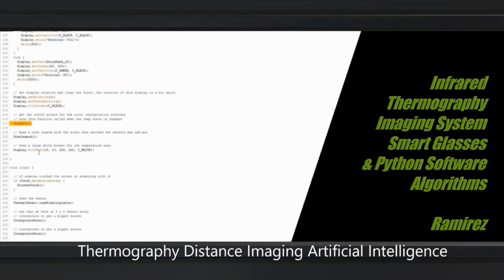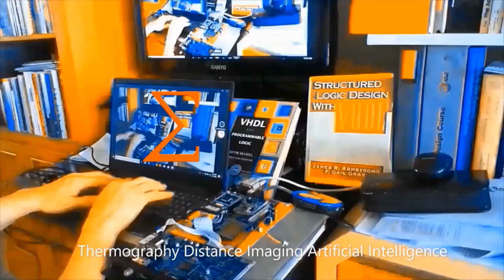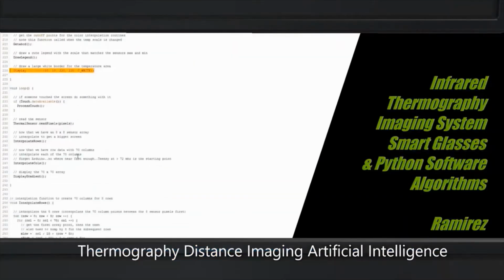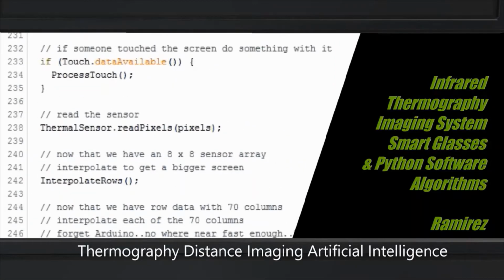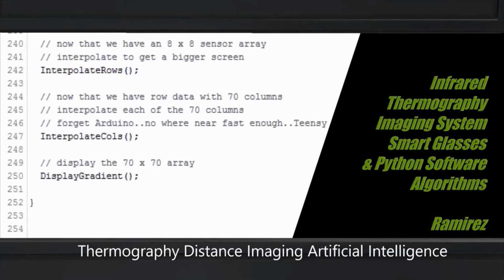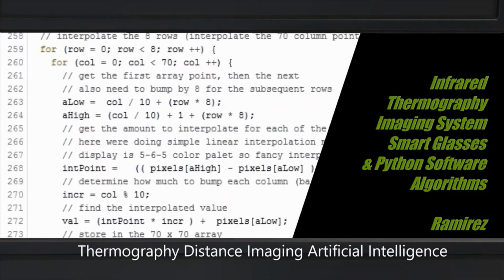The infrared camera used in these smart glasses is used to take images of the surroundings. This may be moving objects or static objects, such as people moving in the streets. Infrared cameras work in a higher wavelength region in order to measure the temperature of the surface based on the detected radiation.